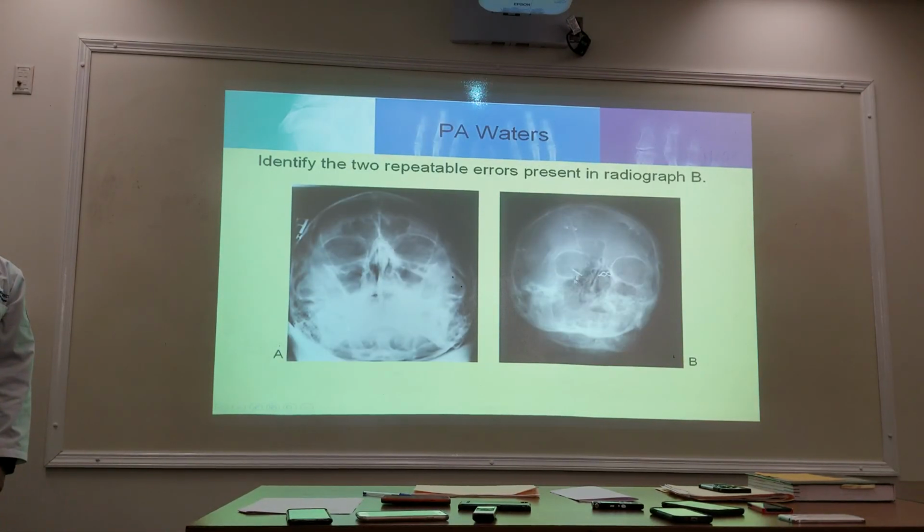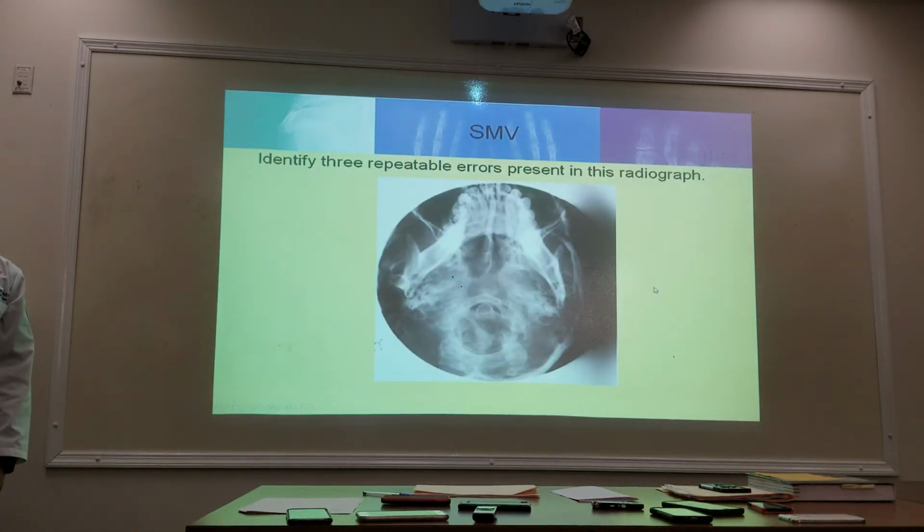Are you guys okay with this? Rotated, tilted, okay. It's just messed up. That's a medical phrase, it's messed up. How about this? Do we have full extension? Does the vertex look like it's on the top of the image receptor? No.